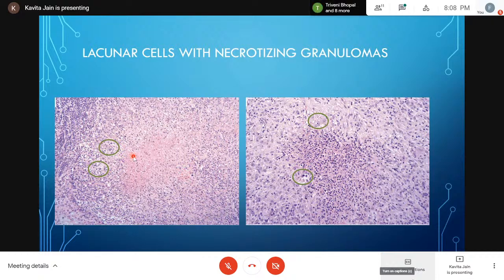In this milieu, specifically with a patient who has a history of mediastinal involvement or a mediastinal mass, we should definitely look for these cells, because lacunar cells can at times look like normal reactive histiocytes. So no harm in putting CD30 and CD15, so that we are absolutely sure that in the biopsy we have received, we have not found any RS cells. I did the same for this patient, and luckily, at least in that true-cut biopsy, there were no CD30 positive cells.